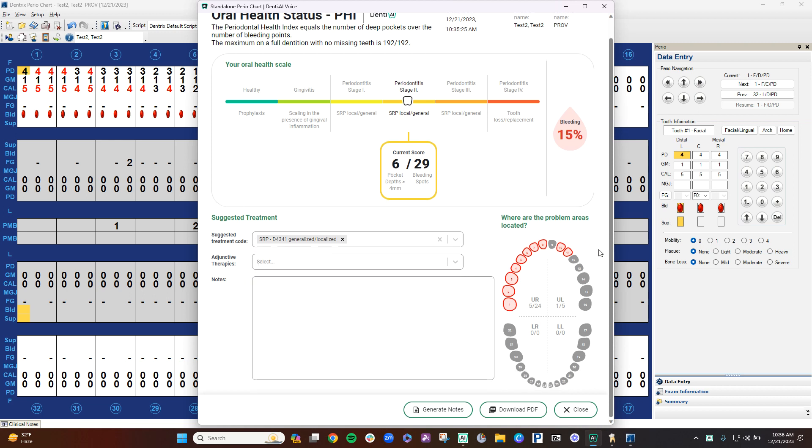For the patient on the odonogram, it shows areas of concern. So the areas in red are areas they can concentrate on. And then for each quadrant, it gives you pocket depths greater than 4 millimeters over the bleeding spots.